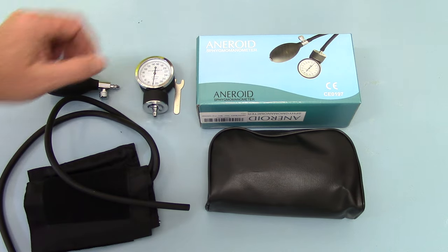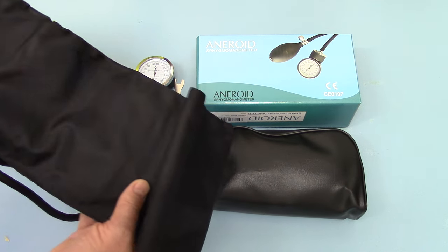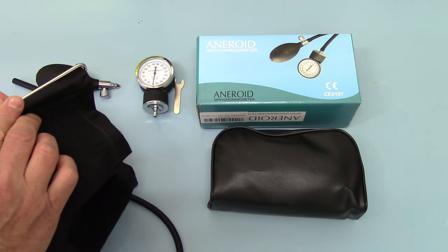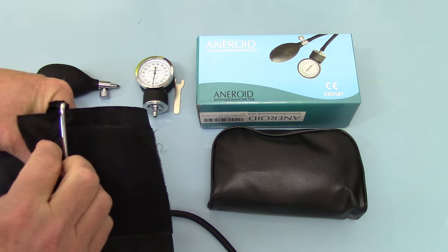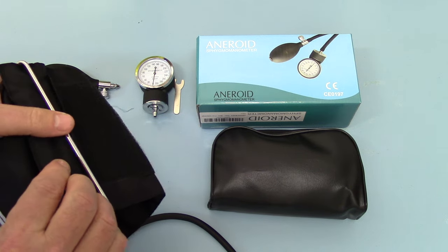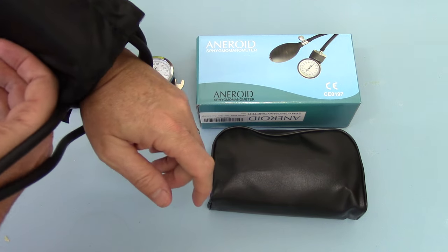The cuff supplied with the unit is a standard adult Velcro cuff. This basically slips through the D-ring like that, and then when it's through the D-ring, the arm goes through like this and it's pulled through and closed over the Velcro.